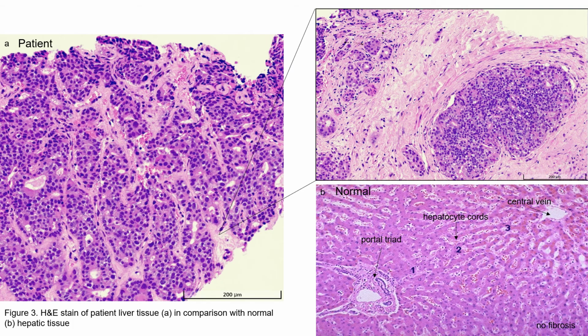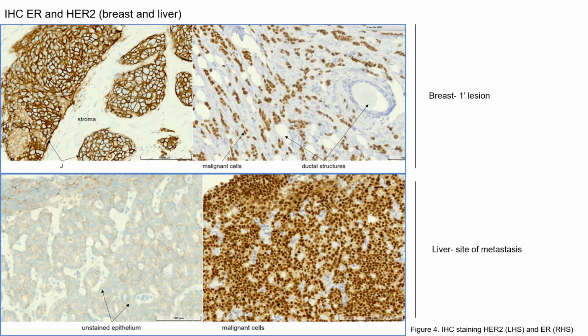We can see the same pathology in liver as in the breast, including single files of tumor cells running through stromal tissue, invasive tumor nests, and total loss of hepatic parenchyma, as demonstrated here in the normal liver sample. An increase in presence of spindle-shaped cells within the fibrous stroma is indicative of desmoplastic reaction against invasive tumor. Presence of tumor vasculature will denote the tumor angiogenesis.